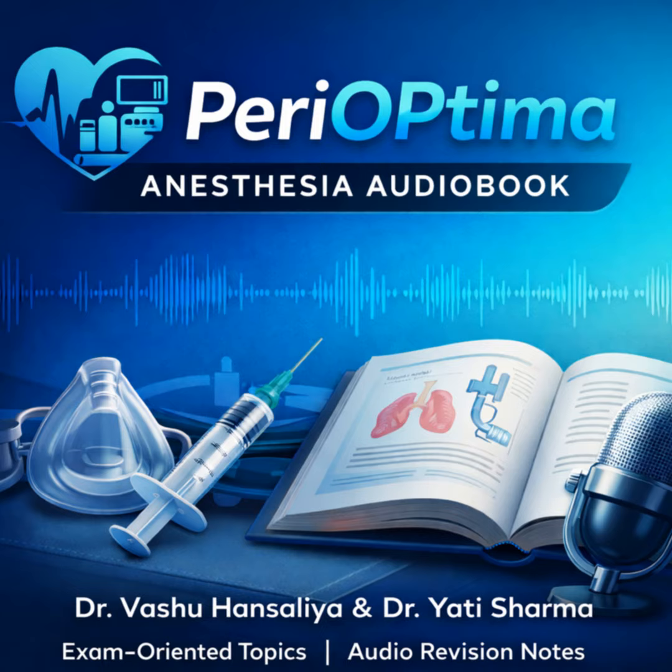3 things. 1, you're identifying the true midline by finding the spinous processes. 2, you're finding the interlaminar space, the window between the bones where you can actually pass the needle. And 3, importantly, you can measure the depth to the epidural space or dura. Which prevents you from going too deep and causing a dural puncture.